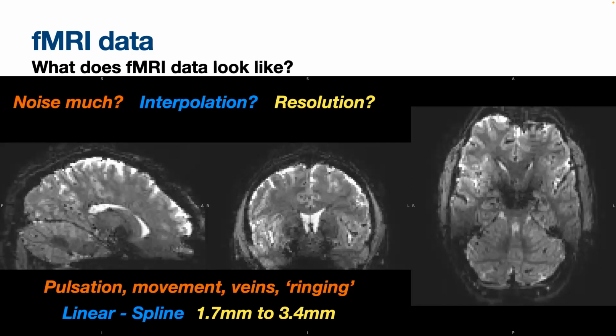That gives you a very nice image, even though you haven't actually acquired all the data. So you use a neural network to impute a lot of the information. Yeah, that's what people are actively developing. The companies that make the scanners, like Philips or Siemens, are actively developing this sort of thing because it means that you can scan people 3 times as fast, right? More patients, more money. So it's a very active area of development.